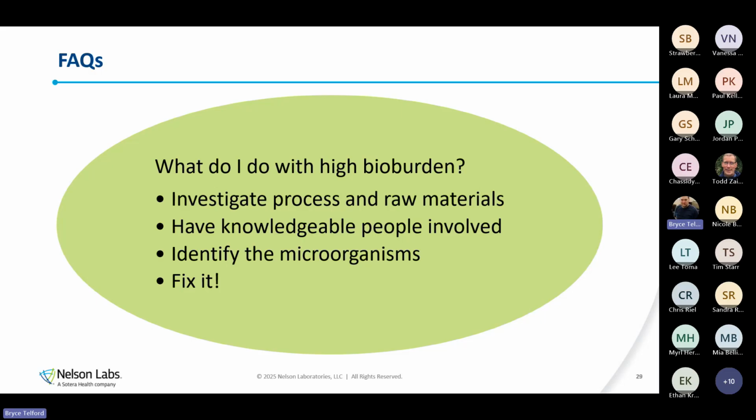And then what do I fix? So I have a story when it comes to knowledgeable personnel and why they are key and critical. We had a manufacturer that had a dose audit failure. They were doing their routine dose audit and they had too many positive tests of sterility. And when we looked back through it, we noticed that they had fairly high bioburden. So they did what we recommend, which is they identified the microorganisms. When we identified those microorganisms, we saw quite a lot of Pseudomonas.